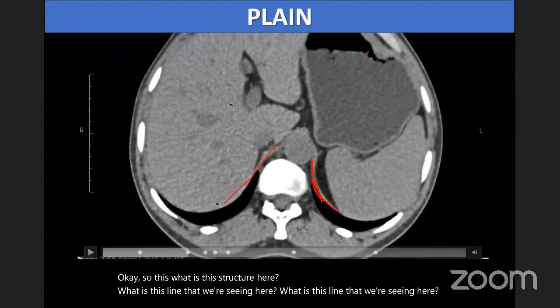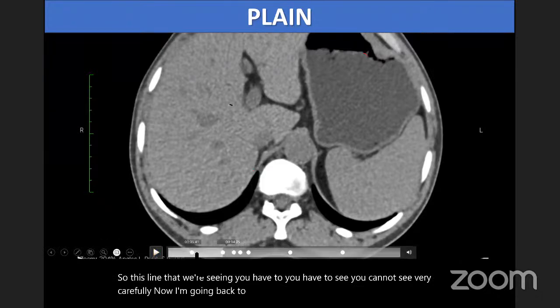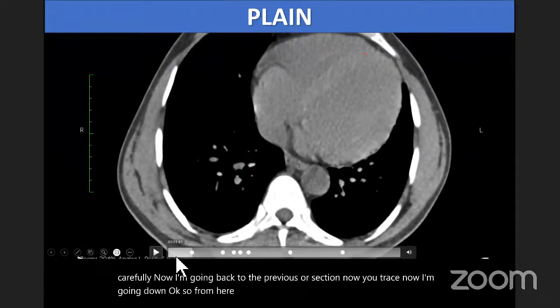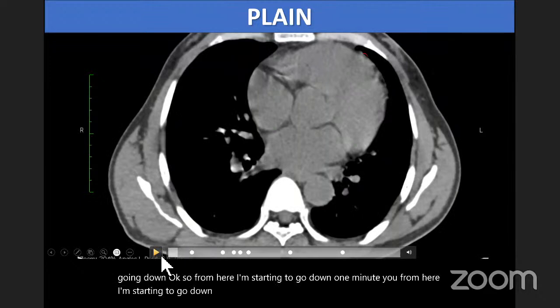You have to see very carefully. Now I'm going back to the previous section. You trace, now I'm going down. From here I'm starting to go down. Now observe carefully the aorta, the descending thoracic aorta.